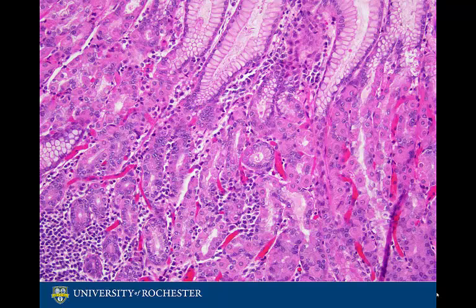The mucosa of the fundus and body contain a mixture of mucous cells and parietal cells, and can be characterized as oxyntic mucosa. The antral mucosa then returns to being predominantly mucous cells.